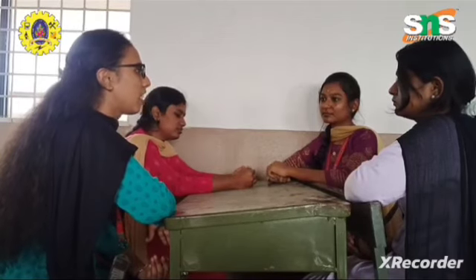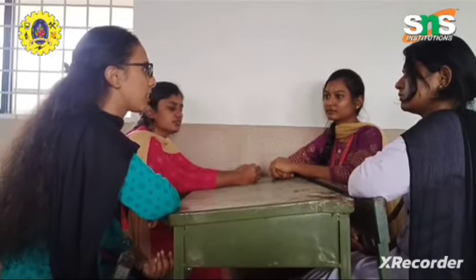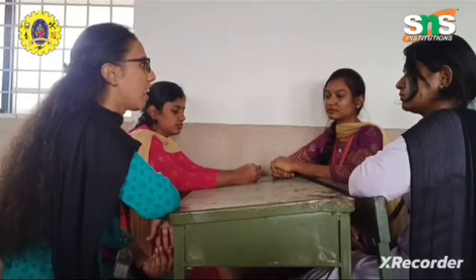There, the test took 20 minutes and they used 2 X-ray images of each breast. One image is from top to bottom of the breast and the other image is side to side. The procedure was a little painful for her because of the compression of the breast to detect it clearly.